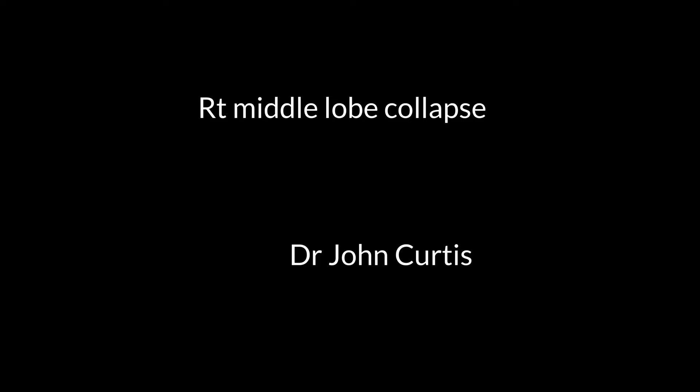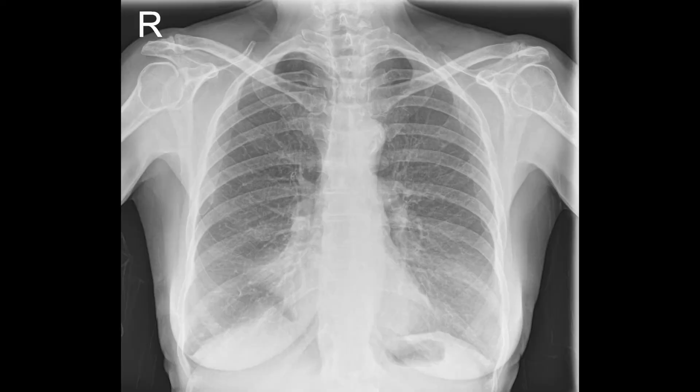This is a short video on middle lobe collapse. This chest x-ray demonstrates loss of the right heart border due to middle lobe pathology. It is quite difficult sometimes to differentiate between collapse and consolidation on the PA film, simply because the volume loss is not great.